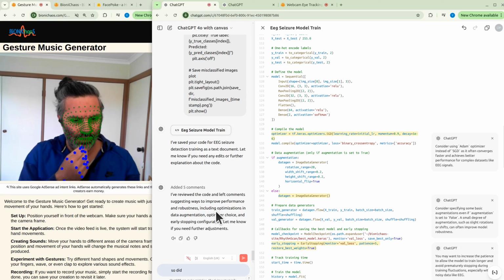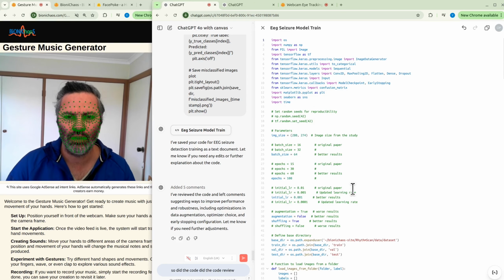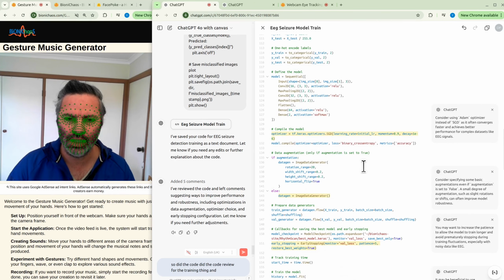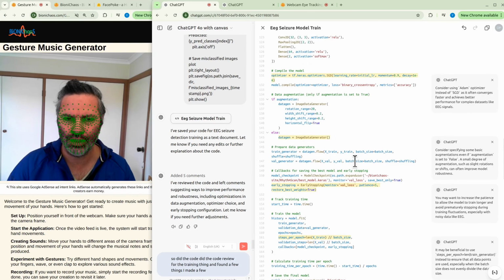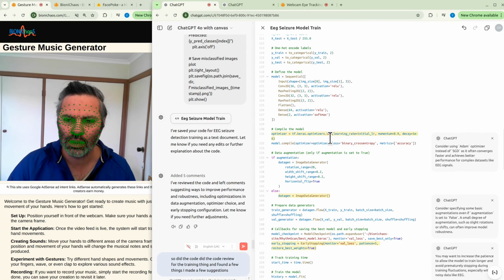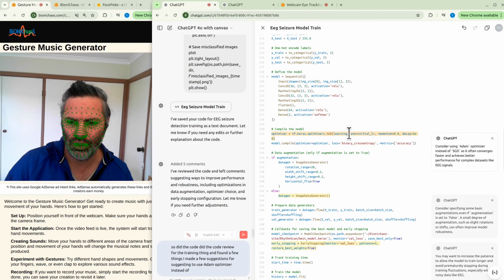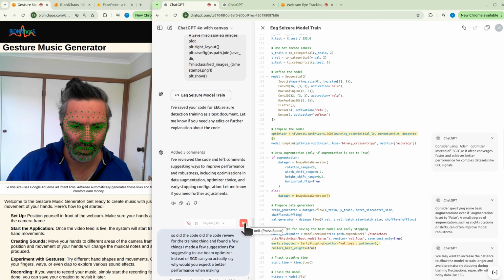So he did a code review for the training script and found a few things and made a few suggestions. I was suggesting to use the Adam optimizer instead of SGD. Can you actually say why you would expect better performance when making this change?